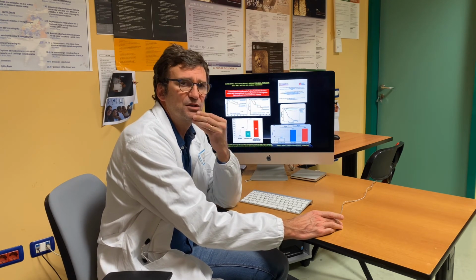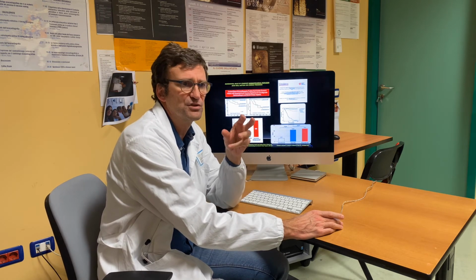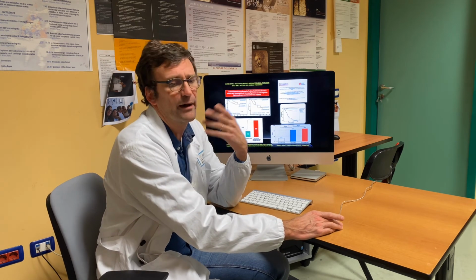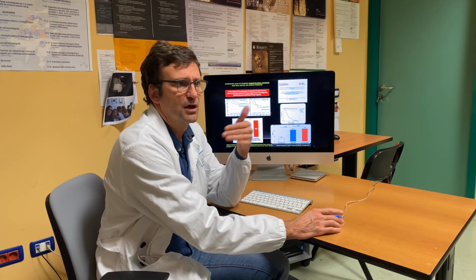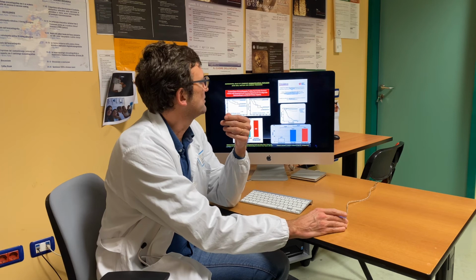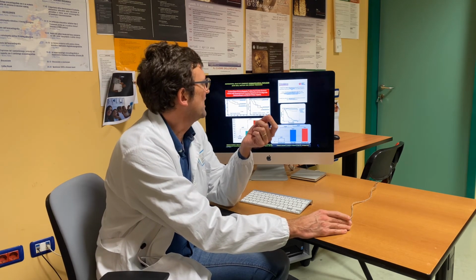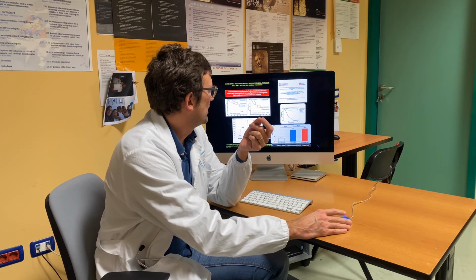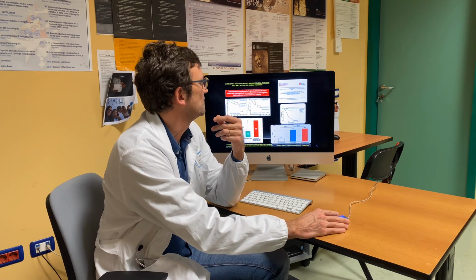The typical thing of stress echo is that you can have wall motion and perfusion at the same time. But if you see now CMR studies, the Kaplan-Meier curves appear the same. You have that normal patients, so normal for wall motion and perfusion, they have an incredibly nice follow-up with few events, so a very low event rate.